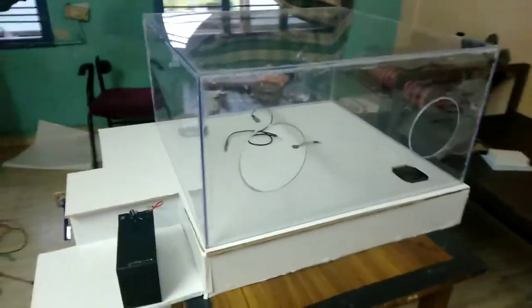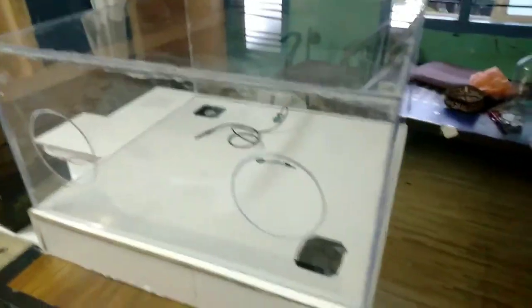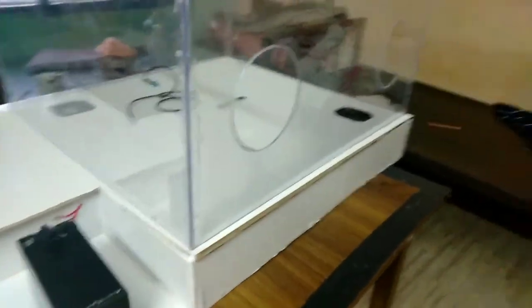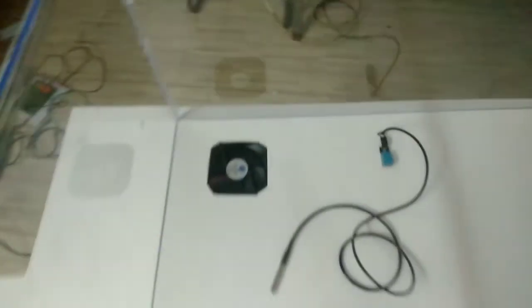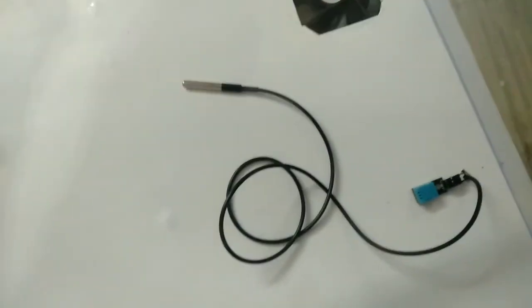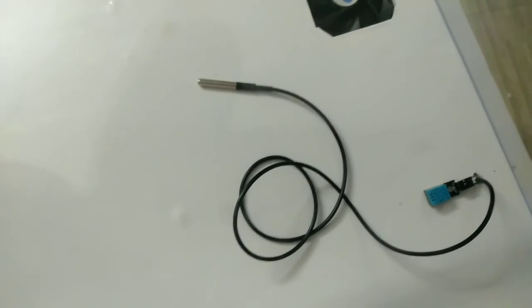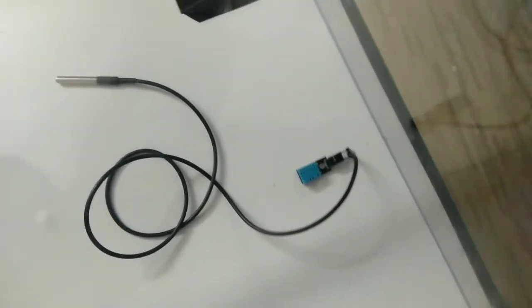So this is an infant incubator for rural Indian clients that we have designed. Basically this is a prototype which works on a battery. As you can see, there's one fan over here and the other fan over here. This is a force sensitive resistor, and the wire over there is the DS18B20, which is a body temperature sensor, and the DHT11, that is a temperature and humidity sensor.